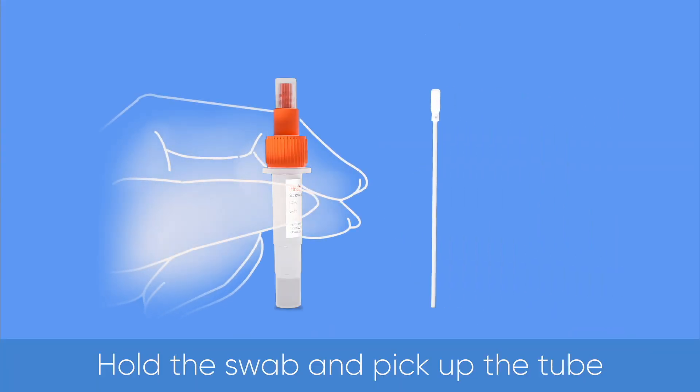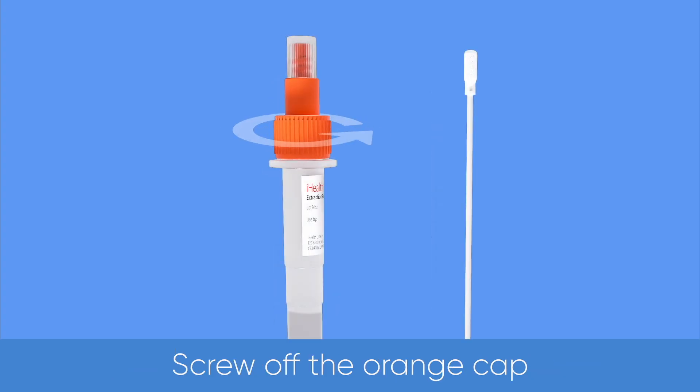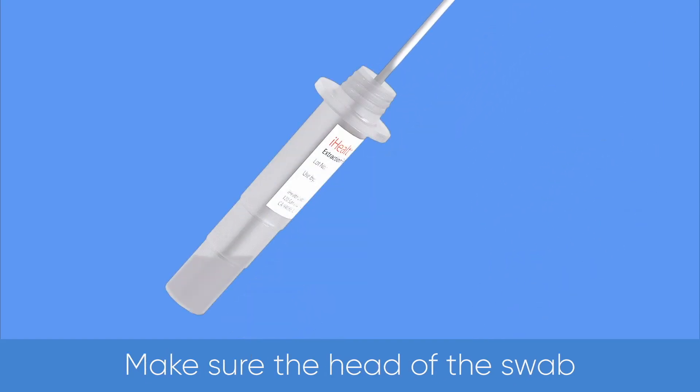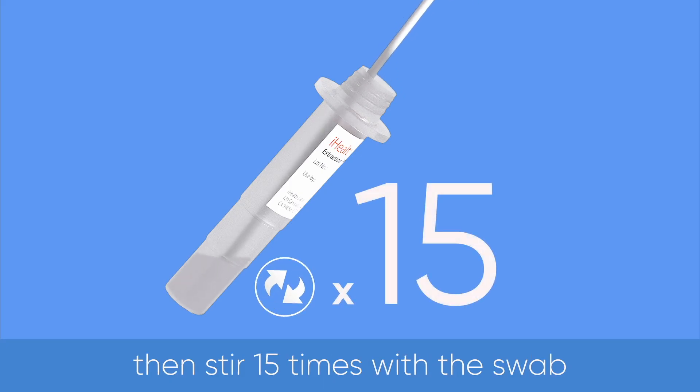Hold the swab and pick up the tube. Tap the tube vertically on the table. Screw off the orange cap. Place the swab into the tube, making sure the head of the swab touches the bottom of the tube.